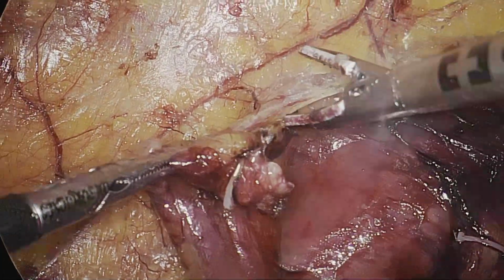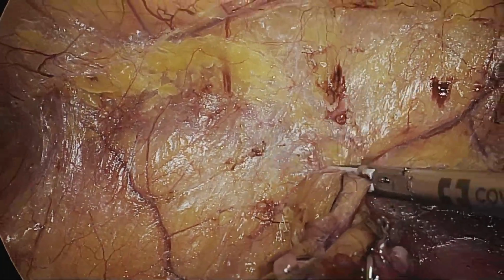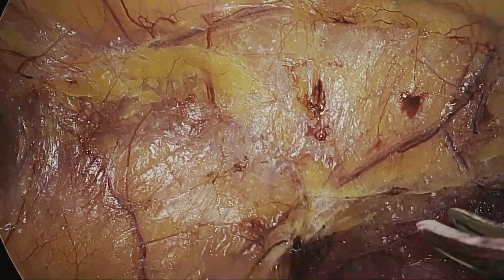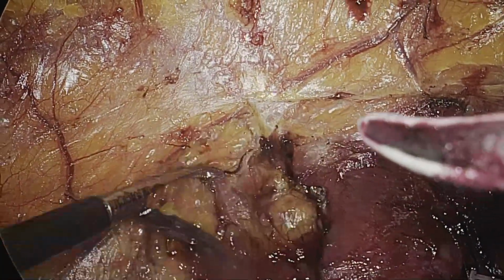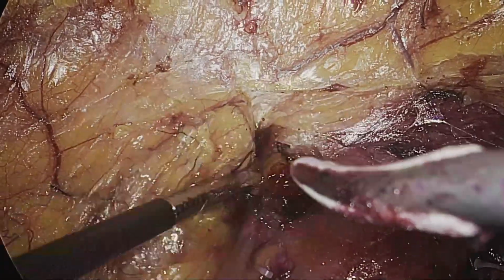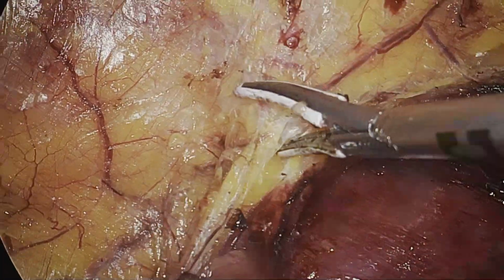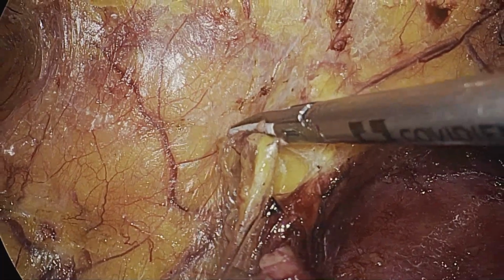The mobilization of the specimen is also important here because we do not want to breach the Gerota's fascia and have fat spillage from within the Gerota's fascia. So we move in an avascular plane around the Gerota's fascia.